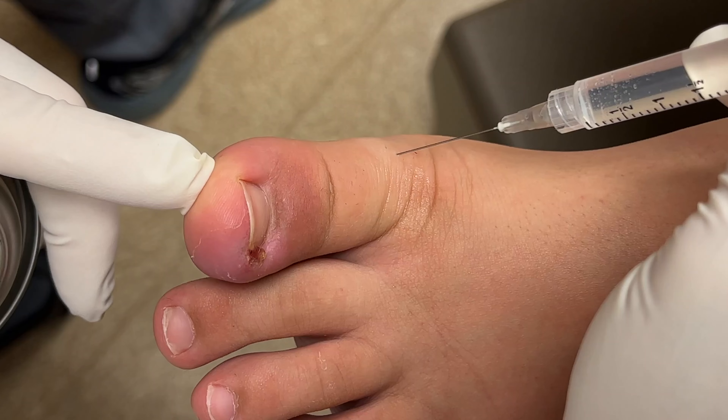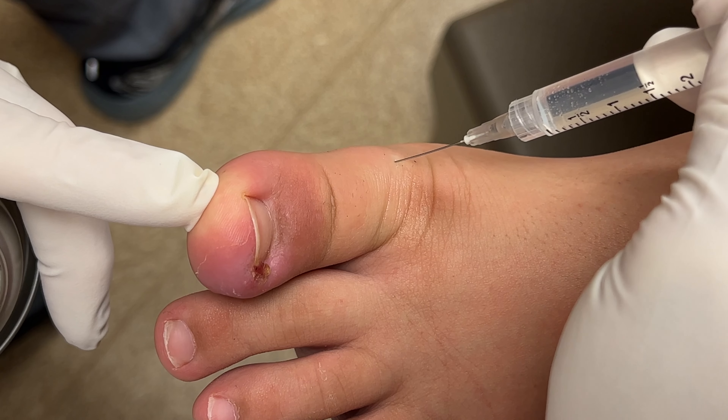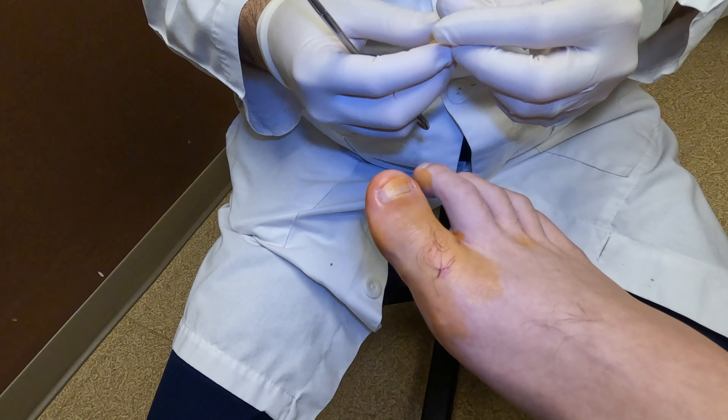The first thing we have to do is numb the toe. We numb the toe by injecting not where the ingrown toenail is — we actually go back to the base of the toe, where there are four nerves. We inject these four nerves with an anesthetic solution. Now the toe is completely numb.